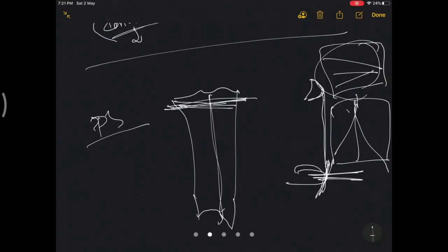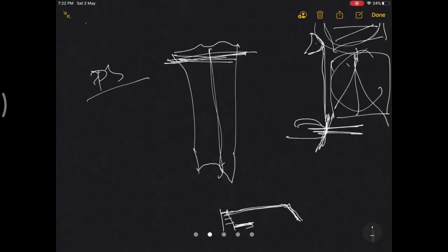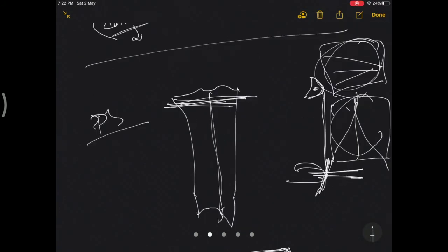Once you adjust the slope and varus valgus, you have something like this, with a metal slide, gradations, and a marker like this, which you can mount on this cutting jig.